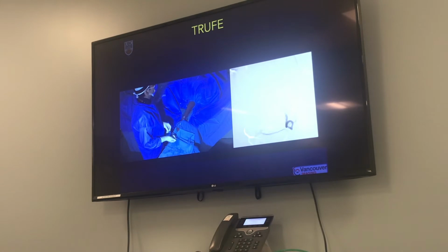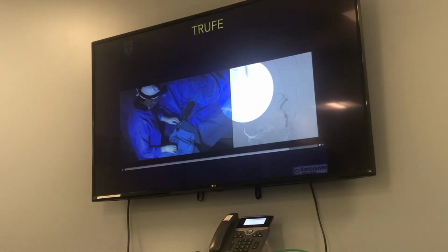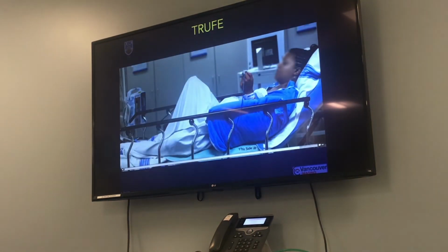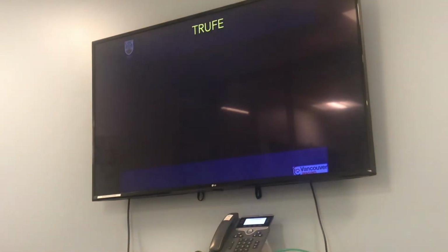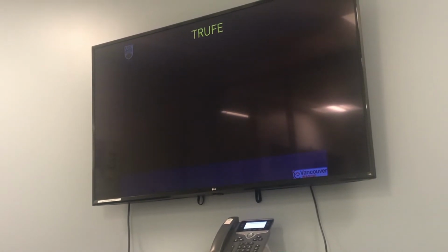So you see no more fibroid enhancing. You want to see very slow flow in the uterine artery. You can see it's almost stagnant. But you're not seeing any of those big abnormal vessels anymore. Those are all gone. Those are blocked off. But there's still a blood supply going to the uterus. It's just very slow, and that's why they don't infarct their uterus. And so that's essentially what happens downstairs every time we do a fibroid embolization.